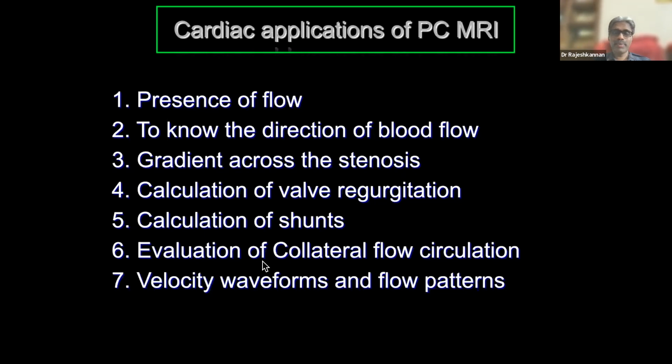For example, in the case of pulmonary hypertension, if you do a PC across the pulmonary artery, it will show multiple peaks during the systole. So that is one of the characteristic features of pulmonary hypertension. So we can look at so many aspects when you are doing a phase contrast flow study.